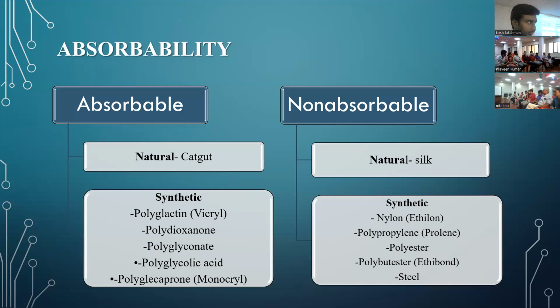They will digest on its own even before the... Not necessarily. In certain areas of the body, though, you don't have very good blood supply and you don't expect the fusion to happen, you need sutures which stay in place for a very long period of time. So there you can't depend completely on absorbable sutures.